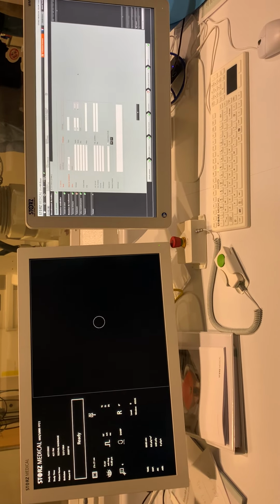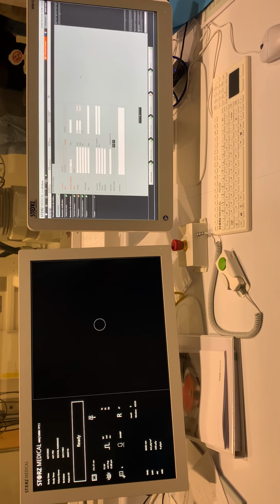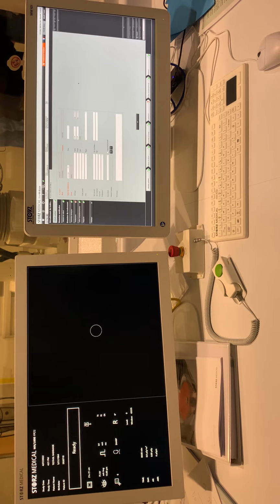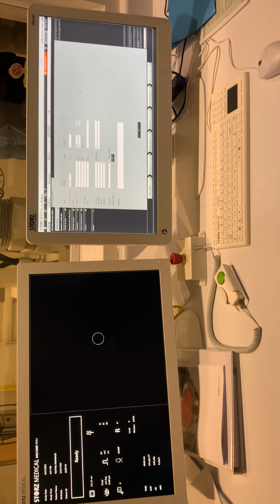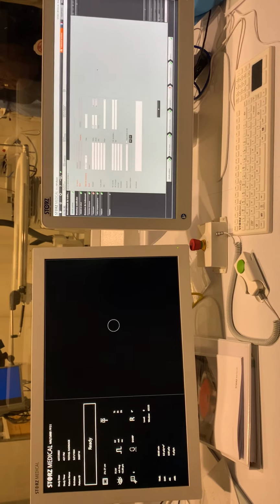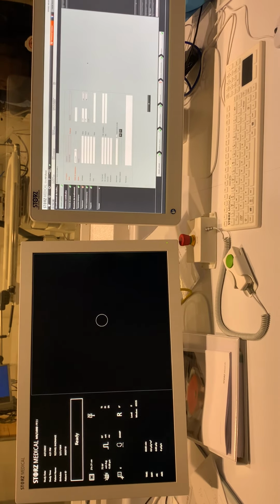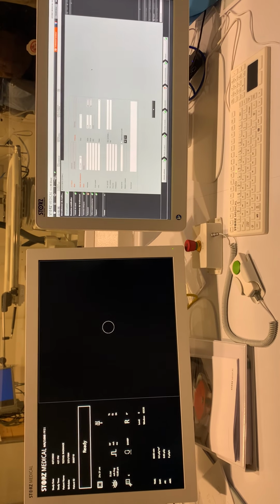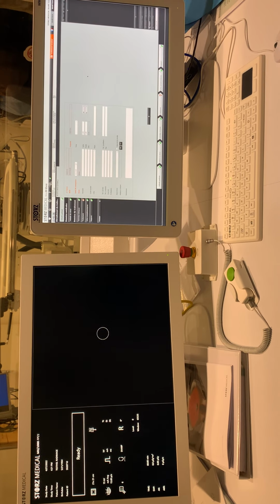Our database called Stormbase, where you can enter a lot of data like you want. I had a nice talk with Dr. Bujani, and he would like to do some research, and it seems like you need to check with all of you which kind of information you want to put in.